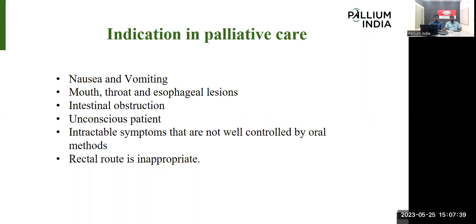For that, some medicines we need to continue in injection form, or we need to maintain the hydration level of the patient for maintaining the quality of the patient. In such conditions also, for an unconscious patient, we can give the injection and the infusion subcutaneously.